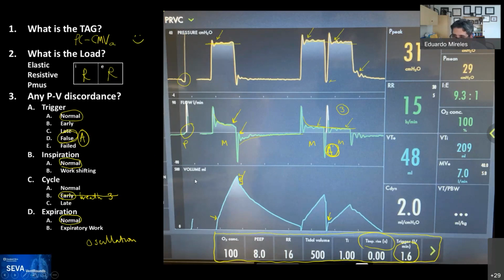No. Yeah, I would say also that I don't have an issue. Rob, I know you wrote a paper on, well, you have written a paper on a lot of things, but you wrote a paper on which mode is better when you have unequal resistances and when you have unequal compliance.